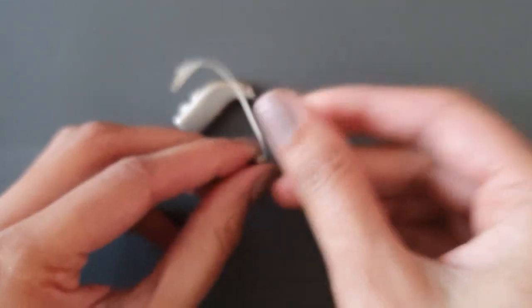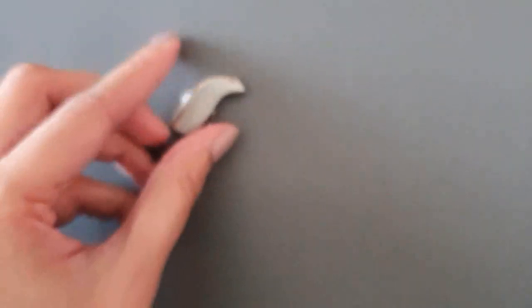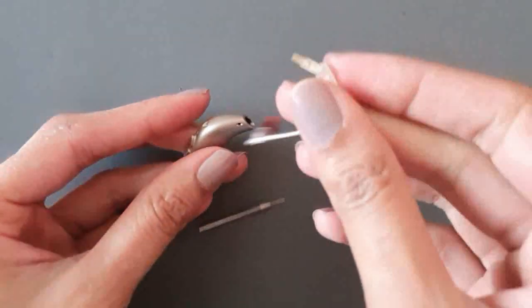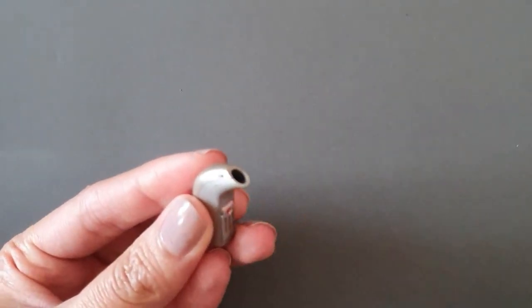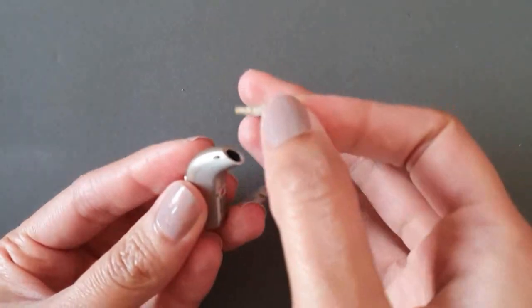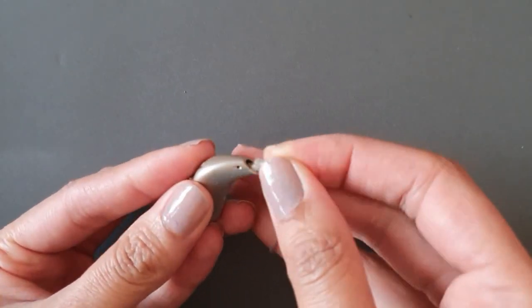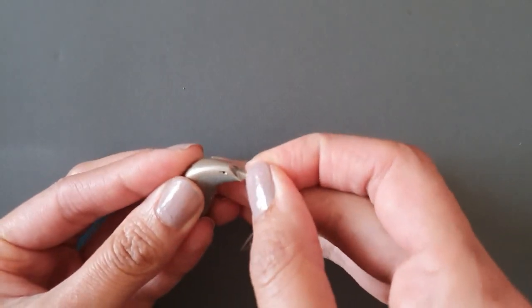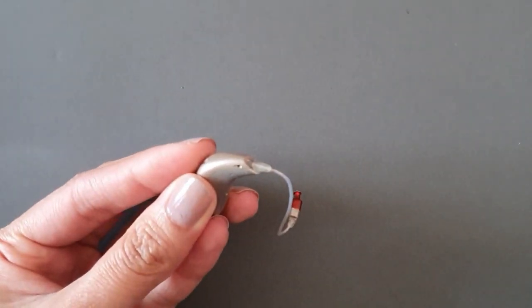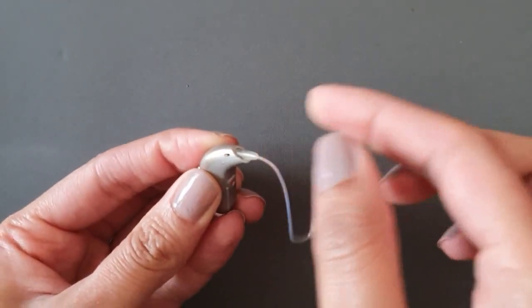Now to reattach your new speaker wire to the hearing aid, find the end of the speaker wire and push it in all the way until it clips into the hearing aid. Now if you were to tug on the speaker wire, it will not come away.